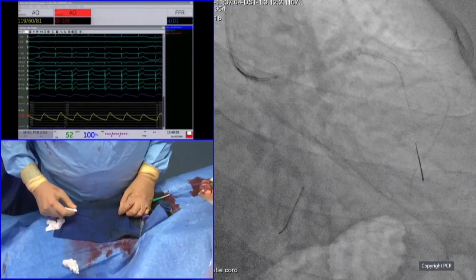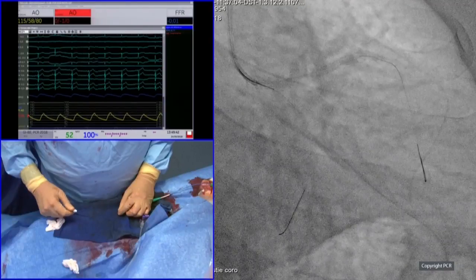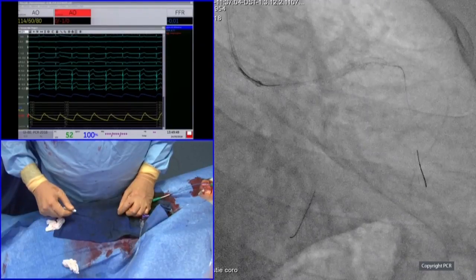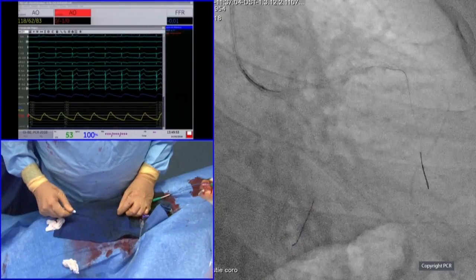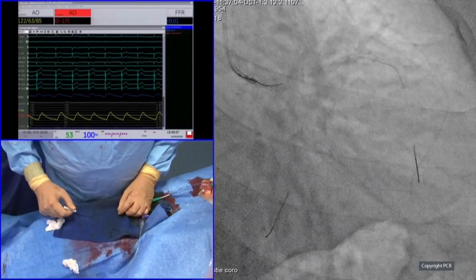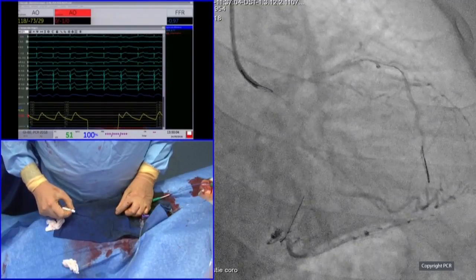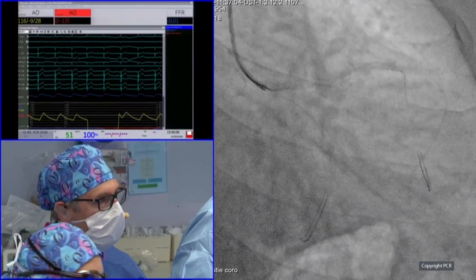Okay, this one is probably the proximal cell. Yeah. Looking for the distal cell. Yeah, exactly. It's a fishing concept. But maybe you are already in the distal one? No, I don't think so. You see clearly that it was a proximal one.